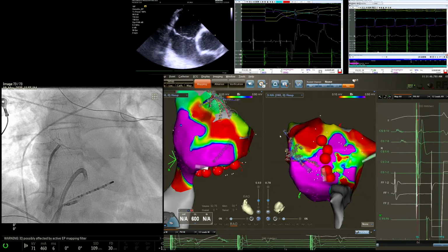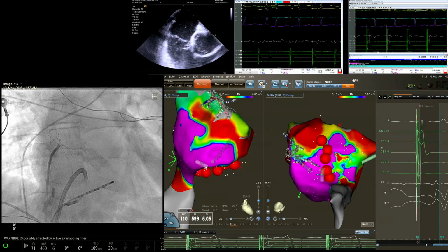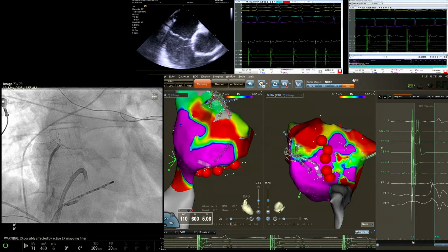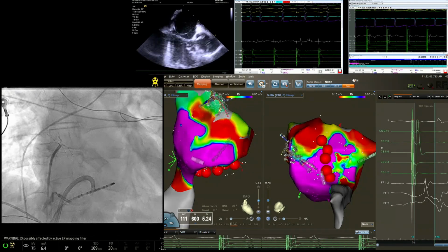So what number of force are you looking for? How much force are you looking for? Again, right now it's just contact or no contact. Okay, so it's a numberless sort of yes/no type of thing. And so yeah, I think we're pretty much done actually.